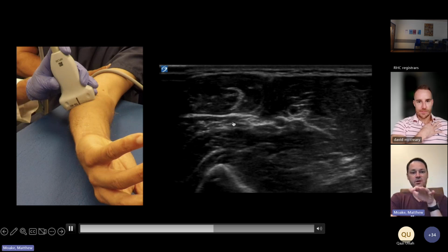So changing gears. The last one I want to make sure to cover is if you're doing lower extremity. Again, different dermatomal coverage, different osteotomal coverage. The big thing to note here is that the vast majority of the sole of the foot is the posterior tibial nerve. Anybody who's ever done a procedure on the bottom of the foot knows that skin is dense. It's really hard to inject local.